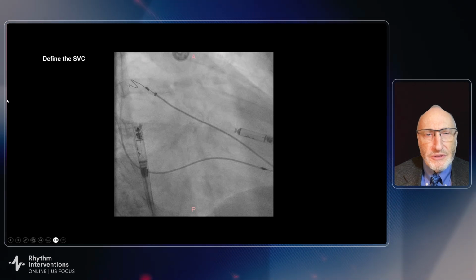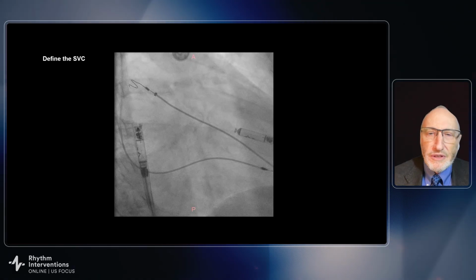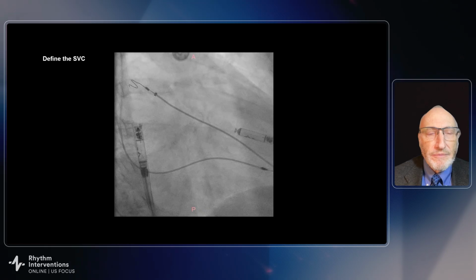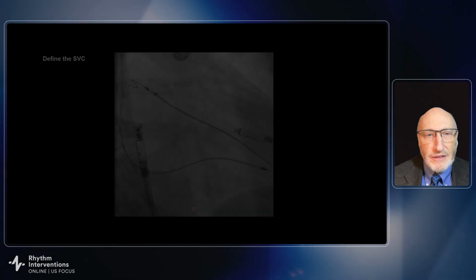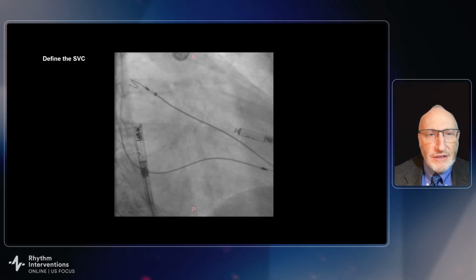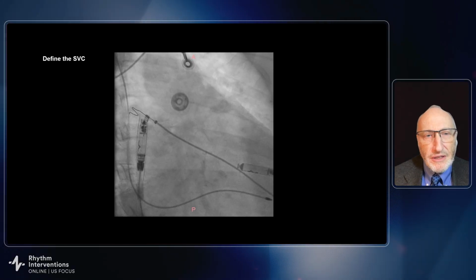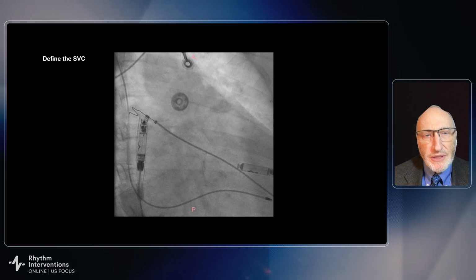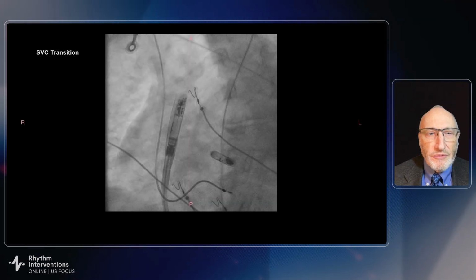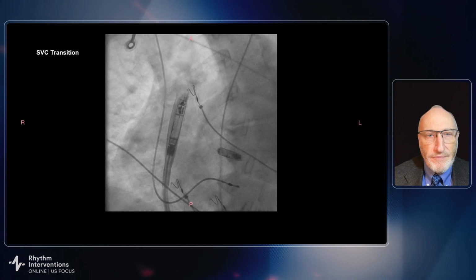This first shows the catheter moving from the, yeah, not seeing it work. Sorry. It should be moving towards the SVC. Hmm, interesting. Sorry. Oh, there it goes. So you can see it just move to the SVC. I have a little bit of curve on it to the anterior, and we also look at the lateral, as you can see here, that's pointing to the septum, and it's along the SVC-RA junction.